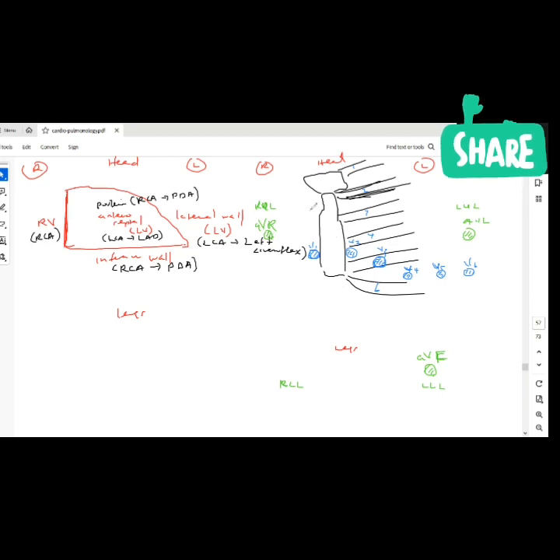The other 3 are called leads 1, 2, 3. Lead 3, based on the location, is looking at the inferior wall. So I just put lead 3 here, inferior. Lead 1 usually goes on this side. And then we have lead 2 as well.